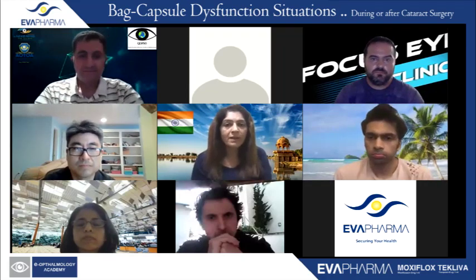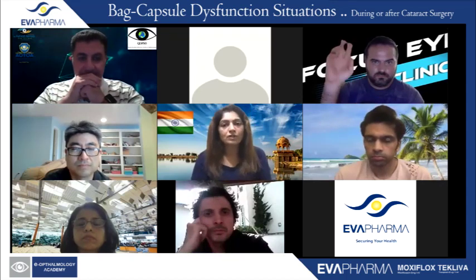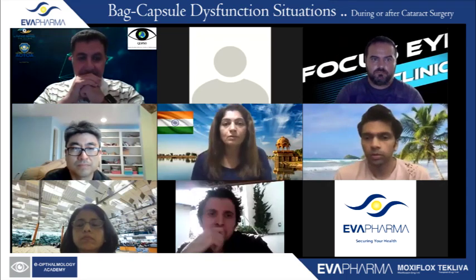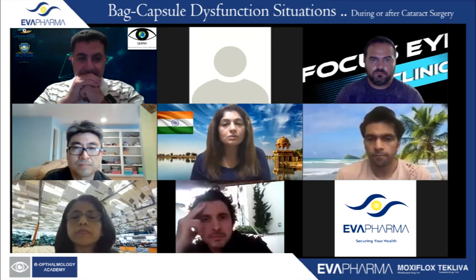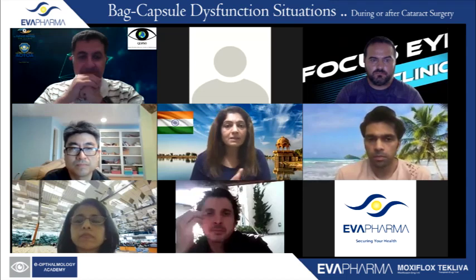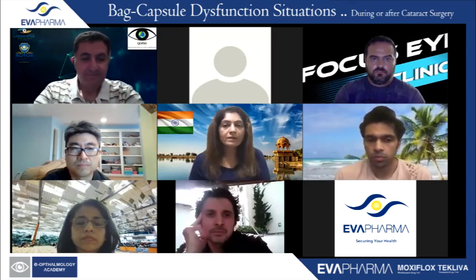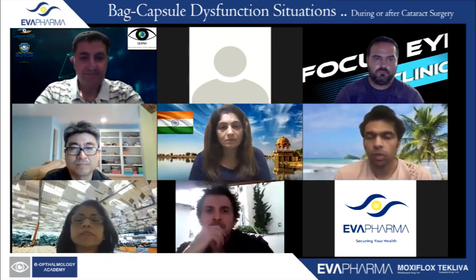So OVDs are only meant for small ruptures, sealing them up and doing a cataract surgery and finishing it off and all that. But when you have to do this, I would recommend that you please use fluid infusion. That really helps you because multiple things are going on. And using fluid is a natural milieu of the eye. So I think that's the best thing you can use.